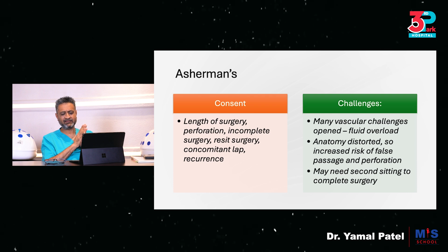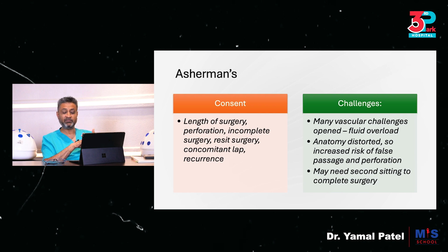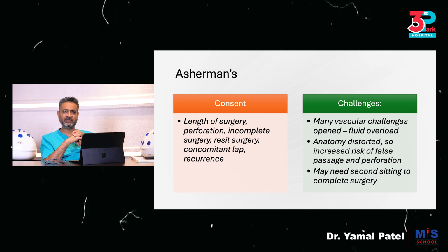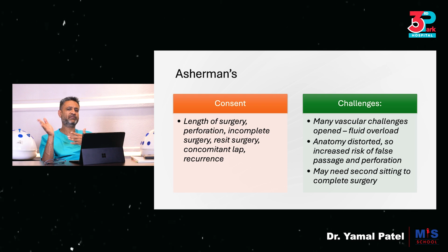What are the issues with consent? It's important to understand and discuss these with the patient. It is likely to be a long procedure. There is a risk of perforation because in Asherman syndrome, you could easily divert off into a false passage and get into a perforation scenario very easily. So you have to discuss this possibility, but reassure her that it should be something not to worry about and we can handle it, and it depends on the tool that actually perforates.